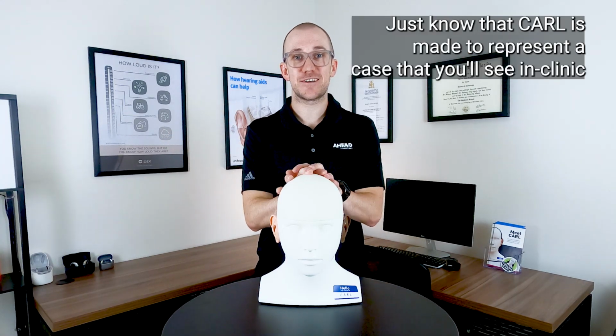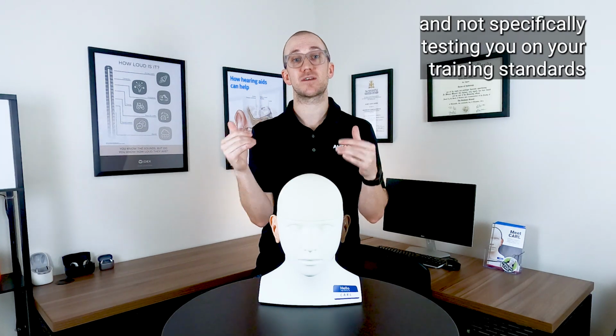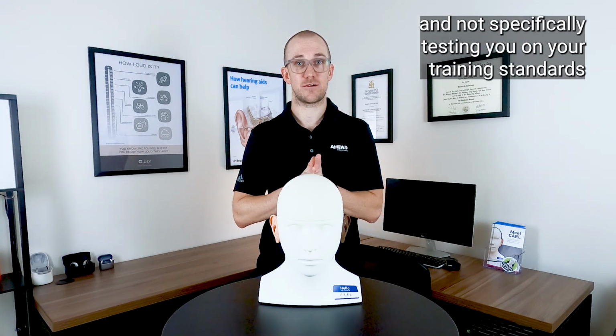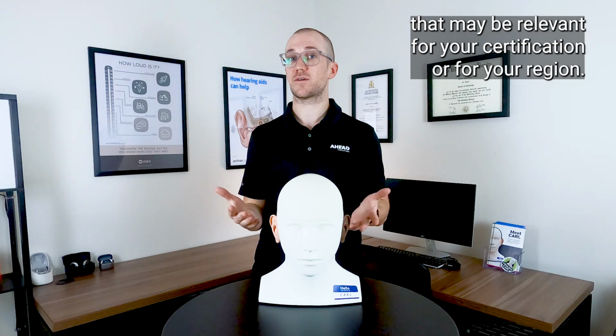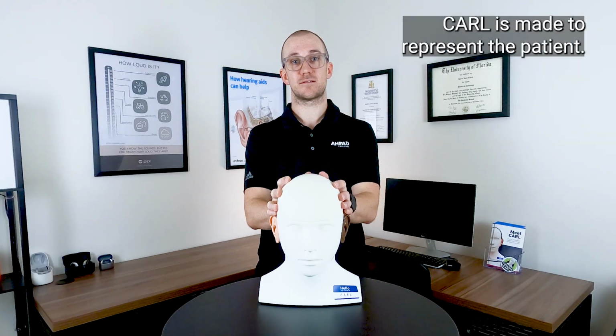Just know that Carl is made to represent a case that you'll see in clinic and is not specifically testing you on your training standards that may be relevant for your certification or for your region. Carl is made to represent the patient.